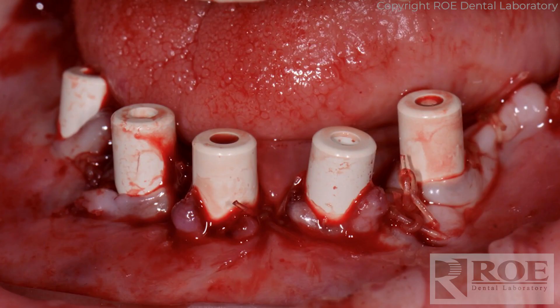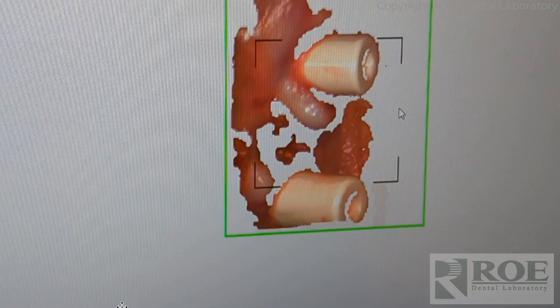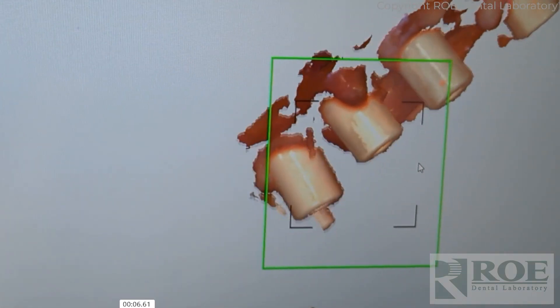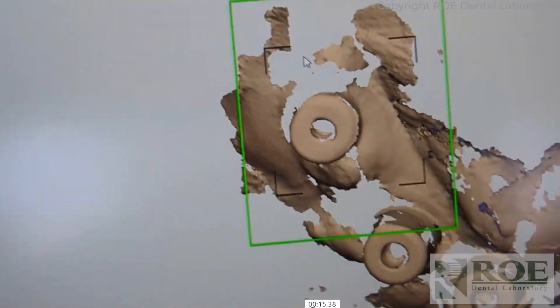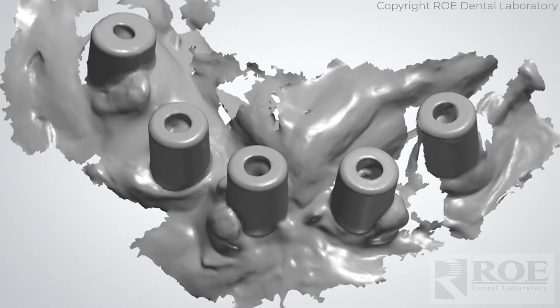Next step: the fixation base comes out, the pins come out, and the healing collars go in. Suture around the healing collars. At this point there's an optional third scan. Many cases we simply build the intaglio of the prosthesis up from the bone at two and a half millimeters without this scan, but if you choose to scan, scan in monochromatic color. This gives us the tissue position for the intaglio of the prosthesis, and the scan can turn out very nicely to build to effectively.